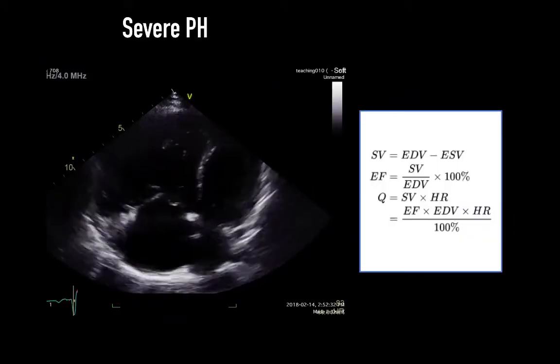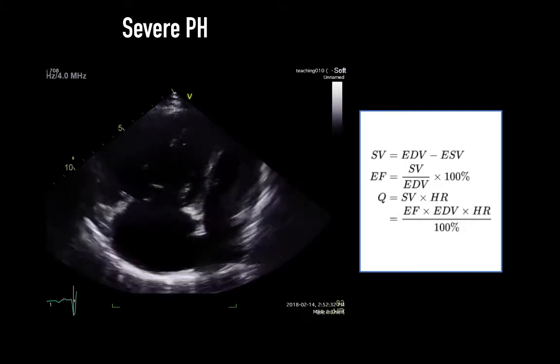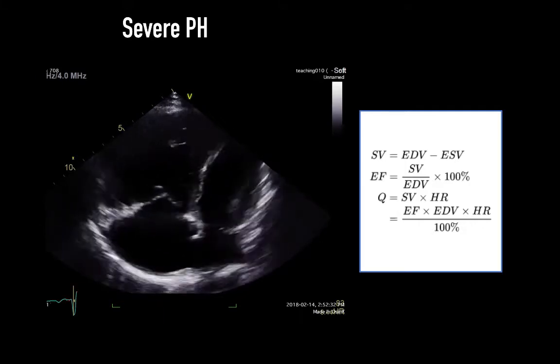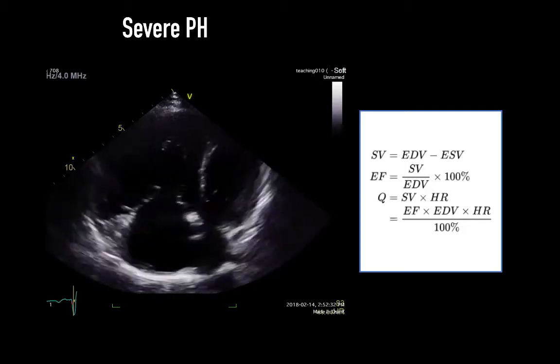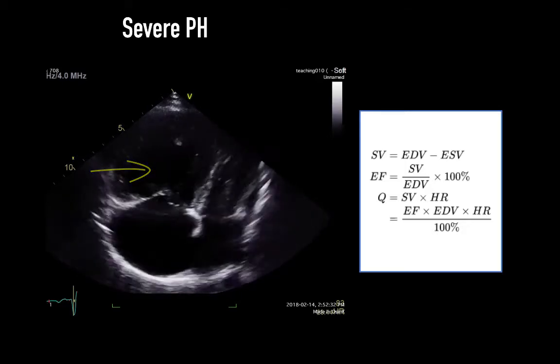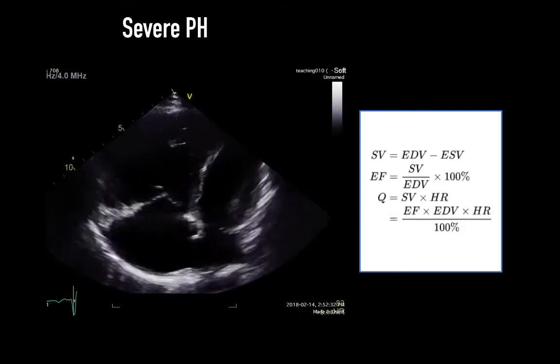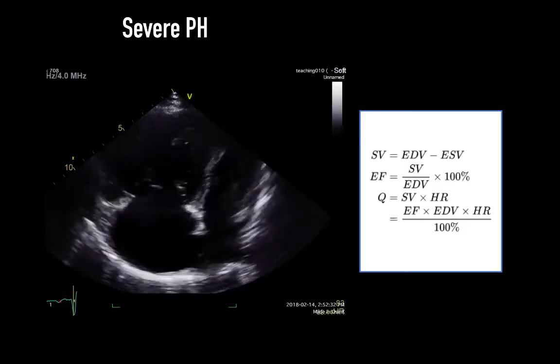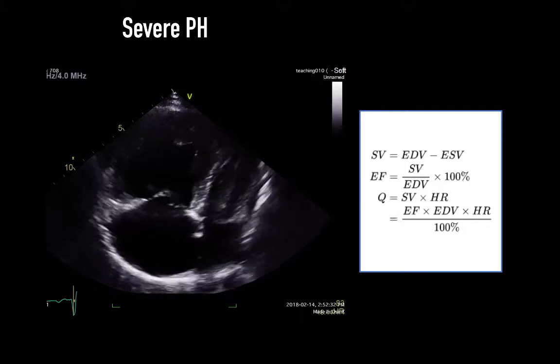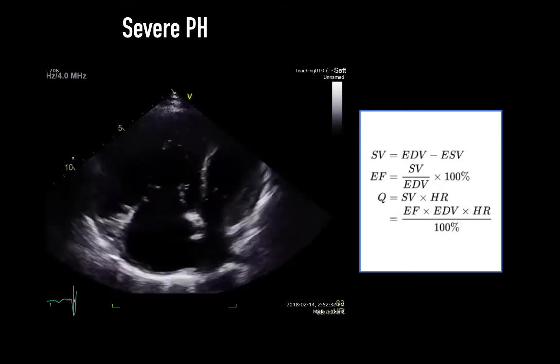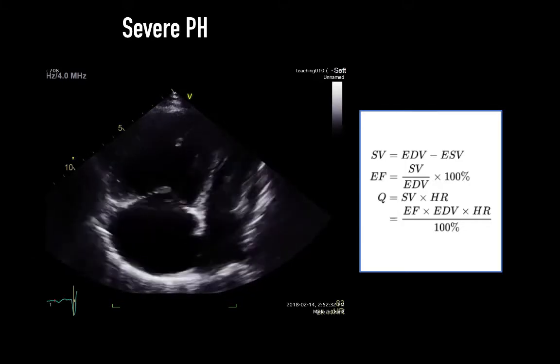Another example of discordance between EF and cardiac output is severe RV dysfunction, as in this clip — where the right ventricle is on the left of the screen. The LV is underfilled because of the low cardiac output provided by the failing RV. In this setting, the underfilled LV tries to squeeze every drop of blood it receives, leading to an extremely high LV EF that does not reflect adequate cardiac output.